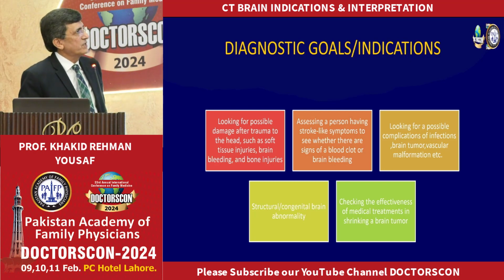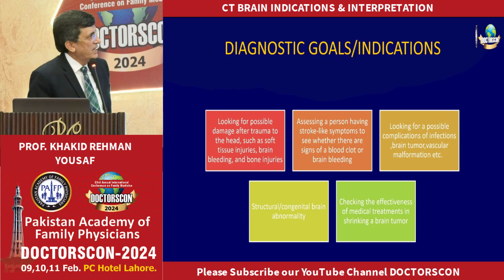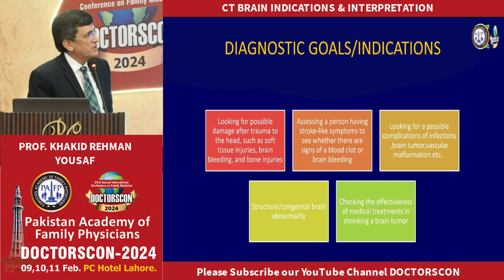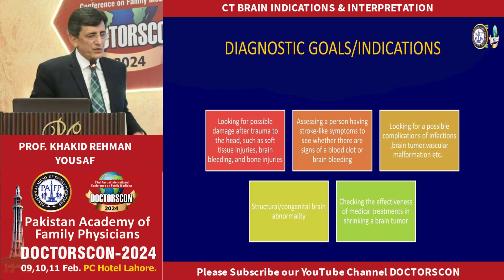What are our diagnostic goals or indications for a CT scan of the brain? We look for brain and skull injuries, bleed in the brain, bone traumas, and certainly the blood, the bleeding aspects again, and the tumors, infections, malformations, structural abnormalities, and checking the effectiveness of medical treatment in shrinking brain tumors.